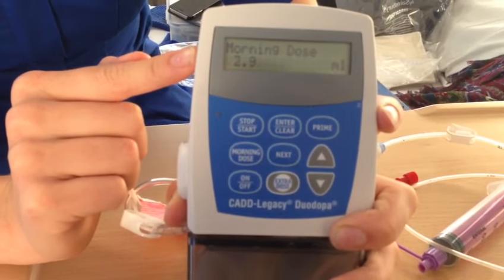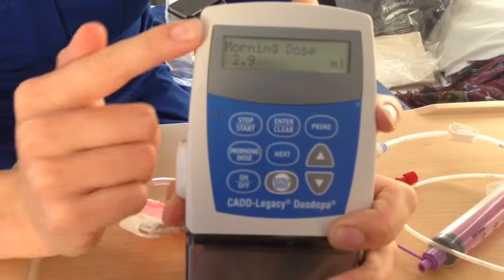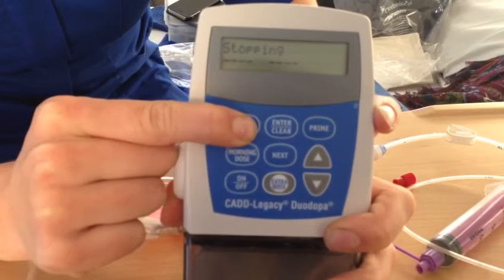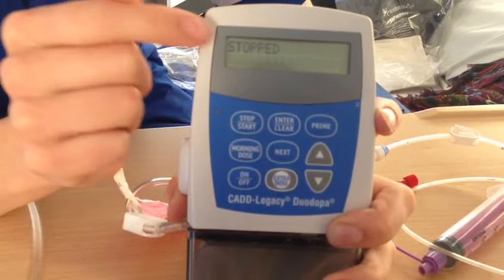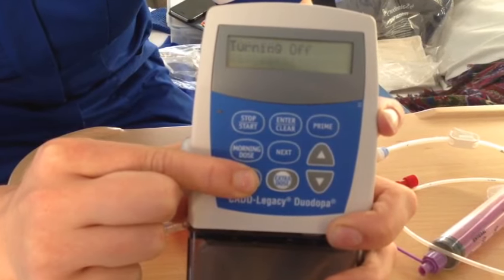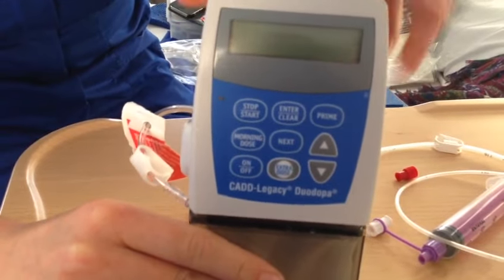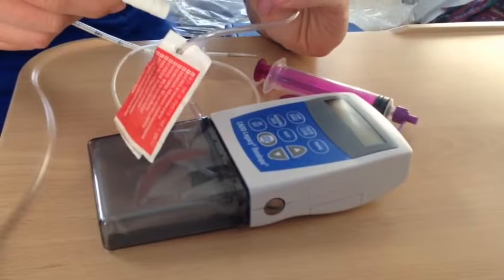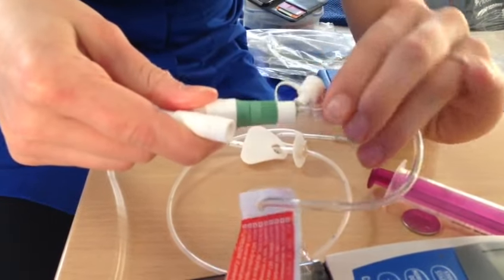When this is finished and counts down to zero, it will go back to saying 'run' in the window. At the end of the day, you would stop the pump. When it says 'stopped' in the window, you can turn it off until there's nothing displayed in the window.